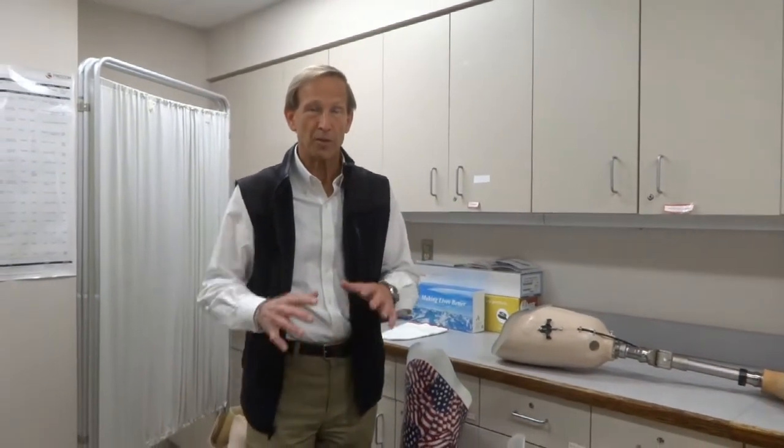Typically, surgeons try to preserve as much length as they can with a fair amount of muscle covering the residual limb, so generally a longer amputation limb is better. The part that goes onto your leg and holds onto you is called the socket, so let's talk for a few minutes about how that socket is designed.